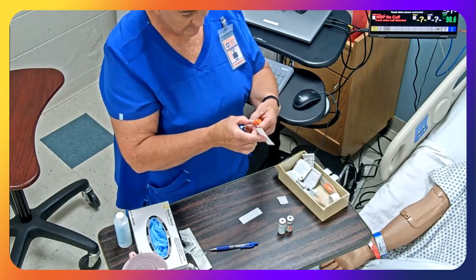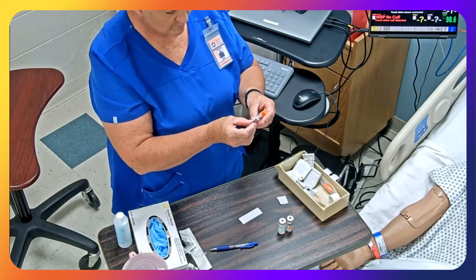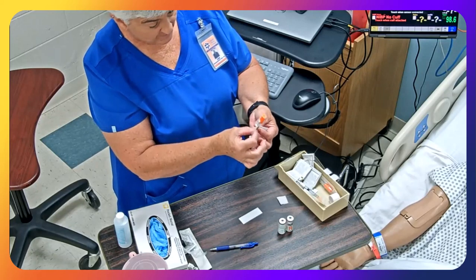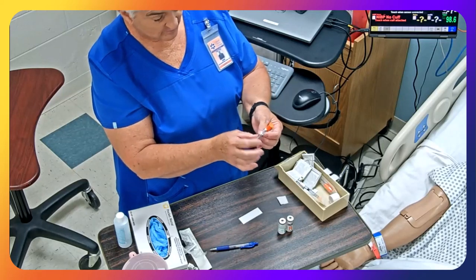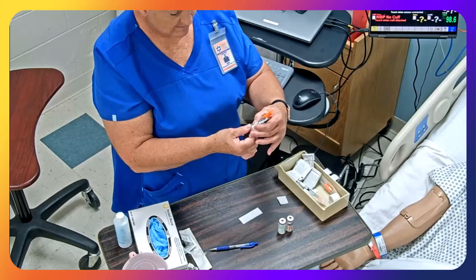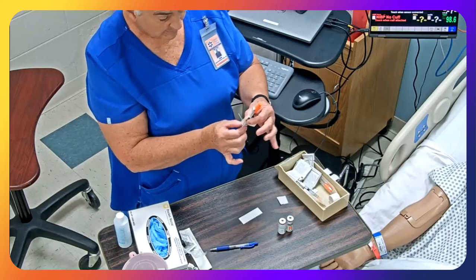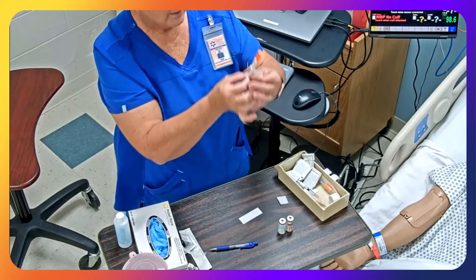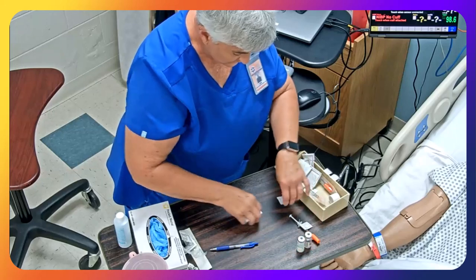Take this off, and I want to put it somewhere where I can still read my label or read my syringe. So this is right, I can still tell how much I have in there, okay? Some people will actually put it on the lid. So I want to make sure that I can still read how much is in my syringe. Okay, and just make sure I still have 20. Okay. So that is my first check.